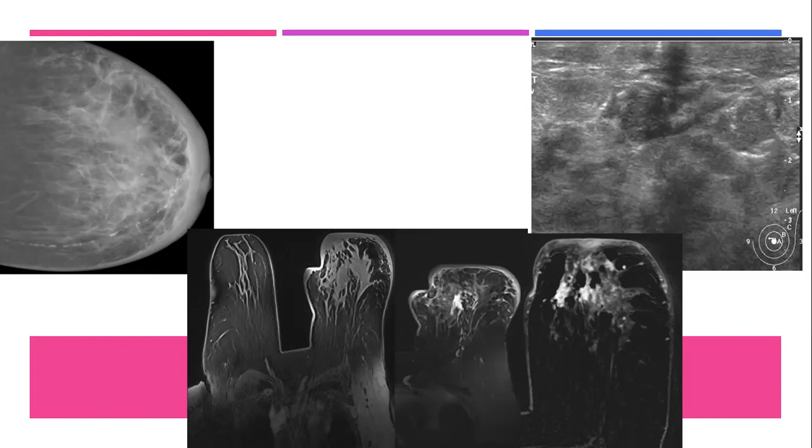If it does not fulfill the criteria of a space-occupying lesion, then on MRI it will not be called a mass.